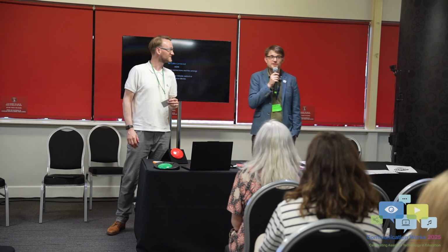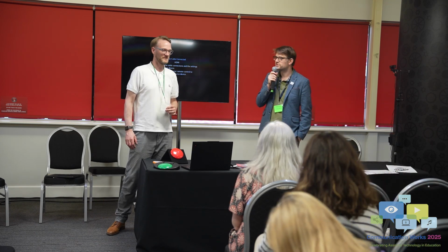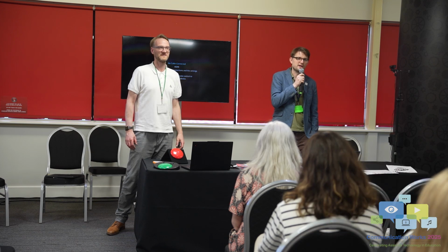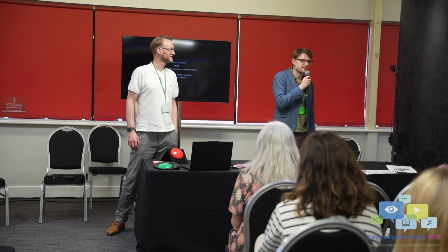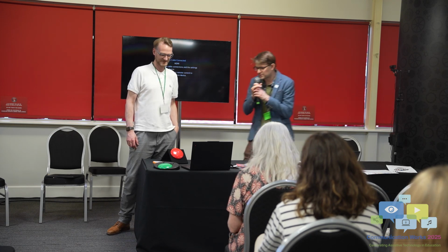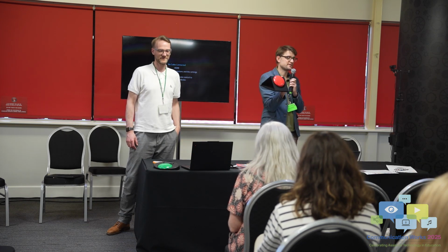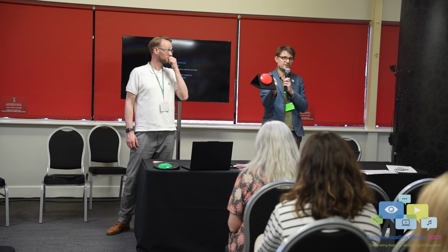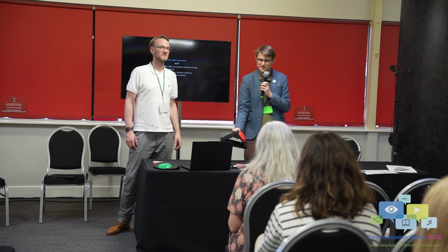We were very fortunate to have a big meeting with the Havering QTVIs a couple of weeks ago. The first thing I would say is to work closely with QTVIs and families who know the young person and know what vision they have, what areas they can see in and what colours they can see. Then we use things like these trifolds and bigger ones and Maxis trays to highlight the colour of the switch. You might bring it into somebody's visual field and then follow it down onto the tray so that they can find it physically.